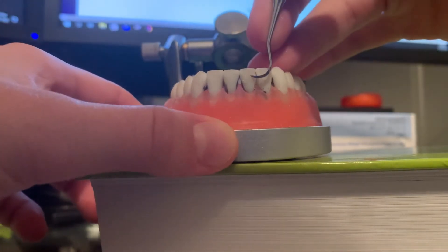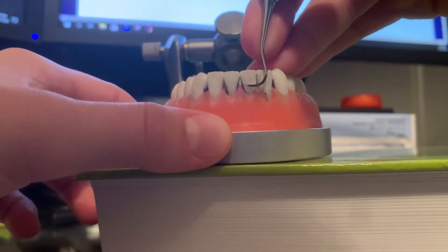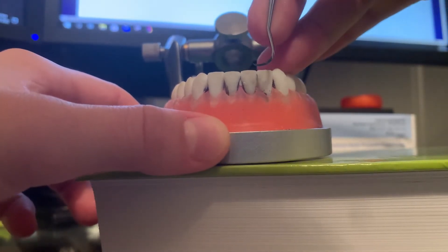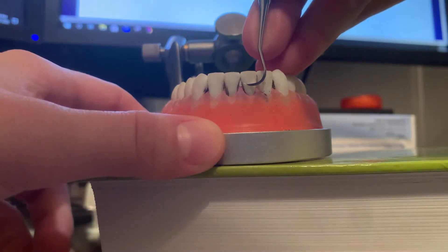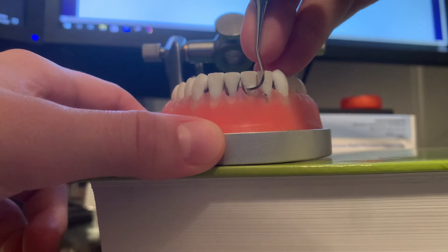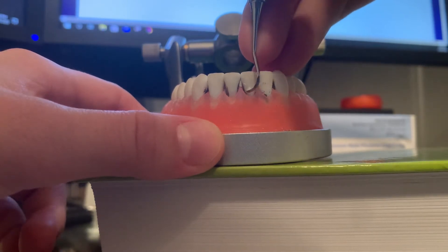First I will start at the midline in the get ready position. I have my fulcrum a couple teeth away from the tooth I am scaling, and I am just working up and down.